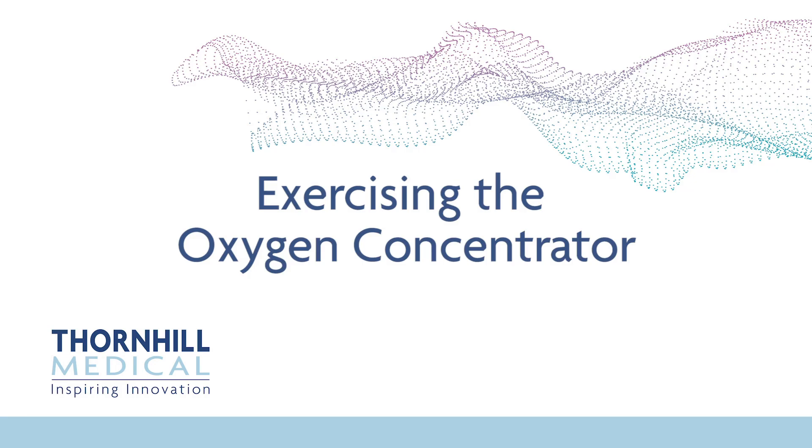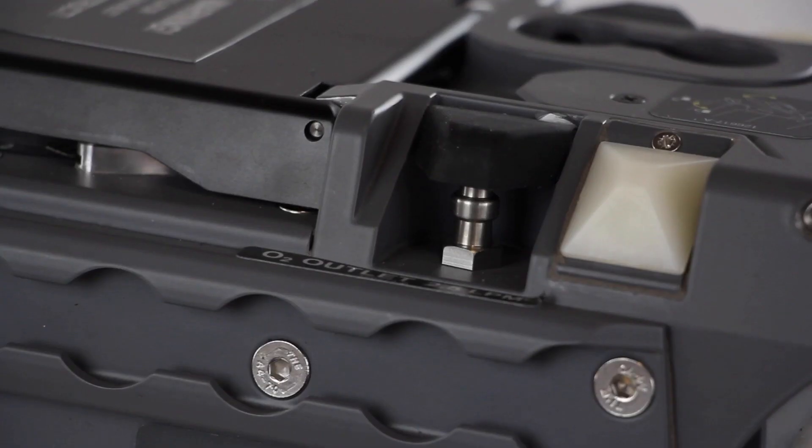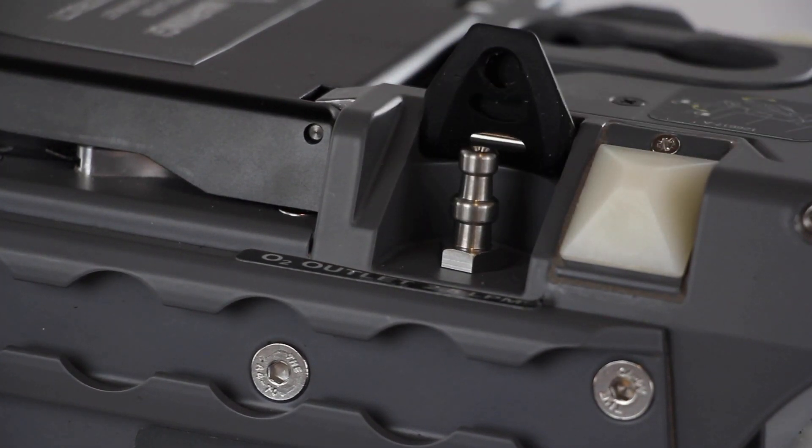Exercising the Oxygen Concentrator. The Oxygen Concentrator must be exercised every three months to ensure that the ATF module does not degrade. Open the O2 outlet port on the top left of MOVES SLC, near the front of the device.